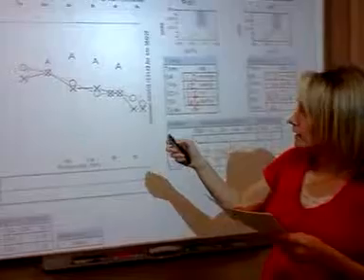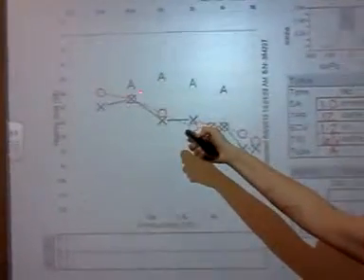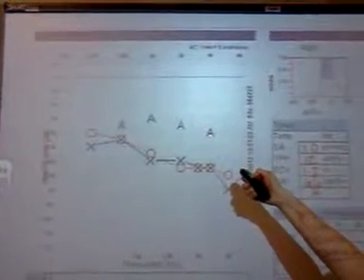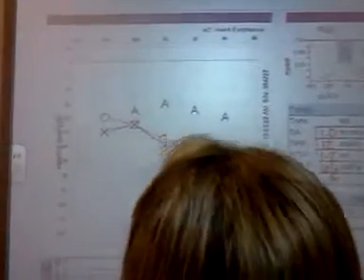When she is aided, her hearing loss, if I look at it, starts at 35 decibels and it goes up to 30, down to 35, and then back to 40.